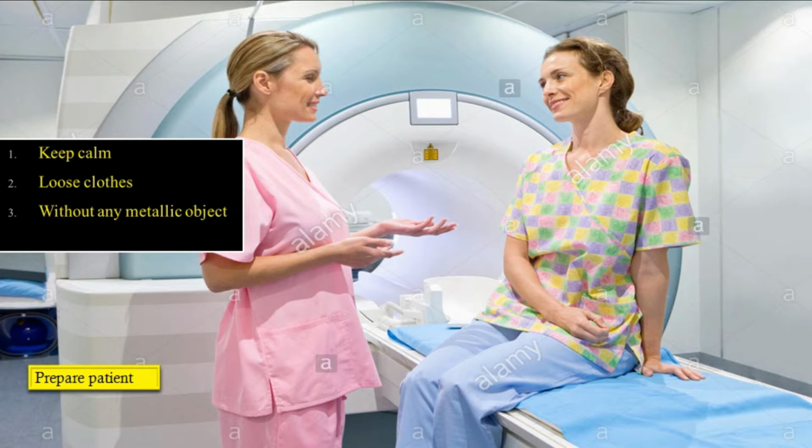We asked a volunteer to take brain images of her. We asked her to come with loose clothes and also without any metal, which has caused serious damage to patients reportedly due to the strong magnetic field of MRI. We explained the whole procedure to her to make her calm, to avoid a further panic attack, which happens sometimes based on different people's psychology.